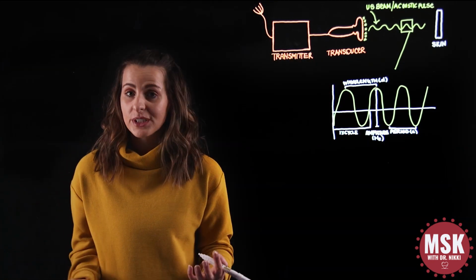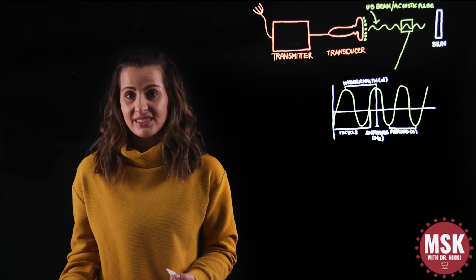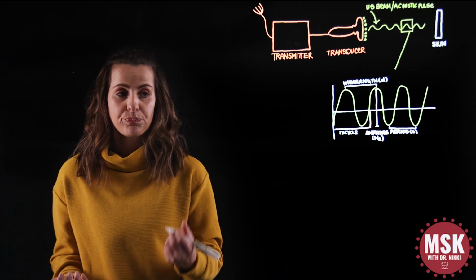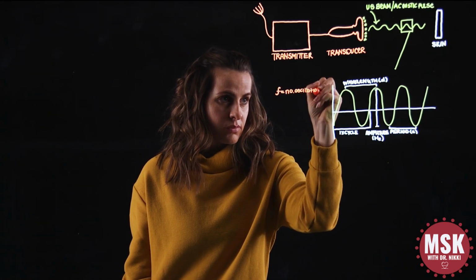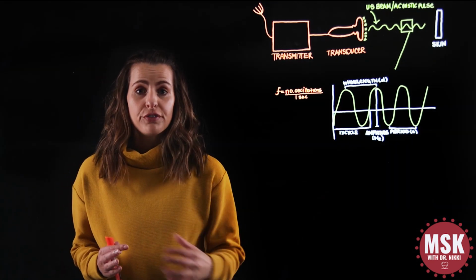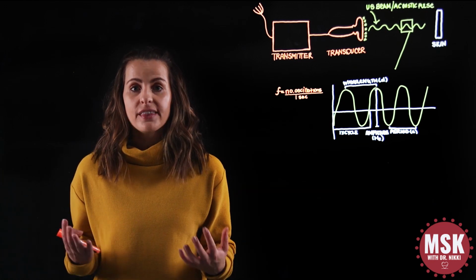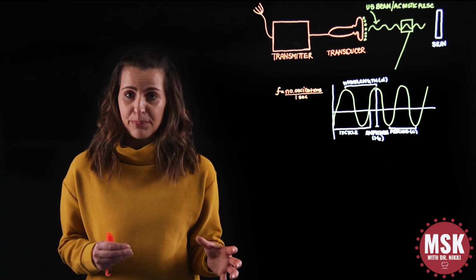Other terms that you're going to come across is going to be frequency. So frequency equals the number of cycles or oscillations passing through a given point in time. A knowledge of the frequency range is clinically relevant because of its importance in the resolution and the ability to visualize structures, particularly at different depths.